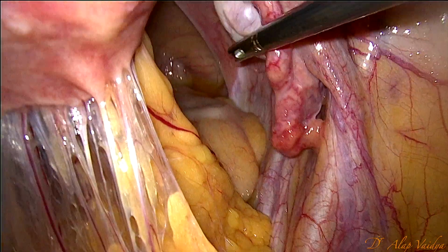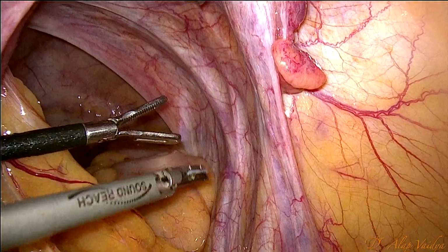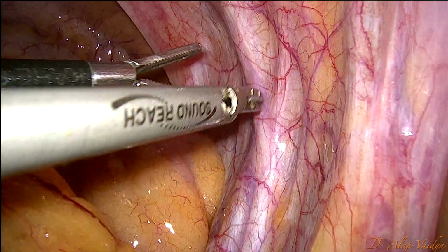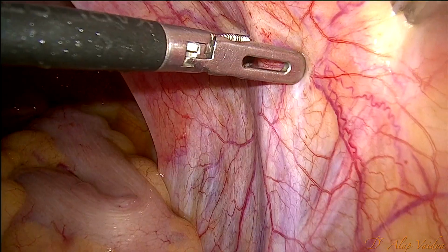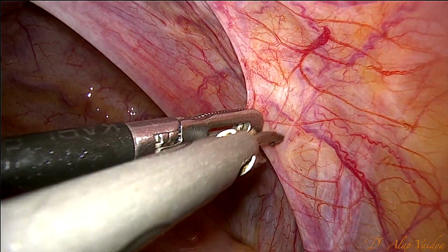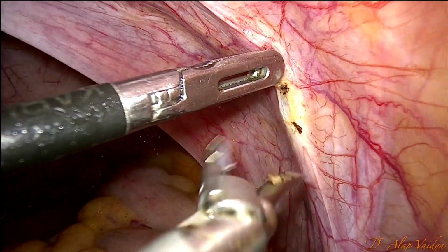Now on the opposite side, we repeat all the same steps. Trace the ureter, look for the uterine impression. If you look closely, you can also see the obliterated umbilical artery going up.